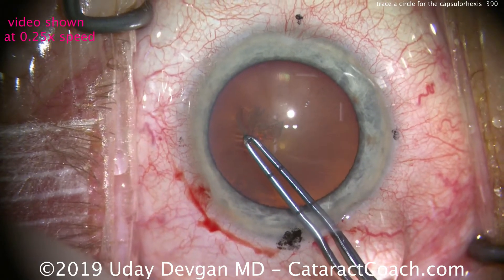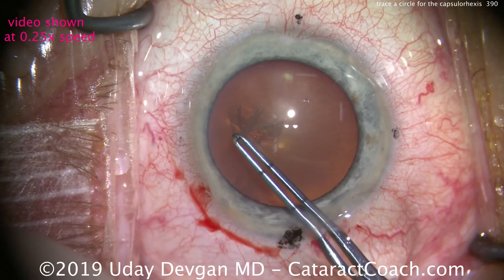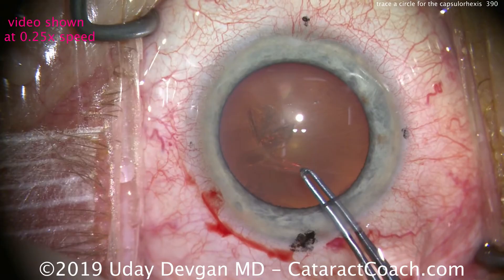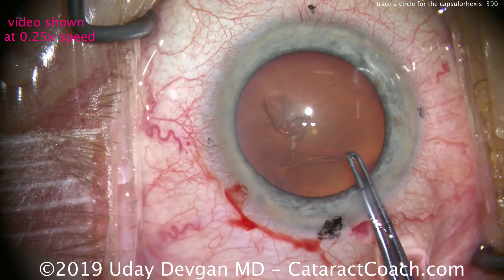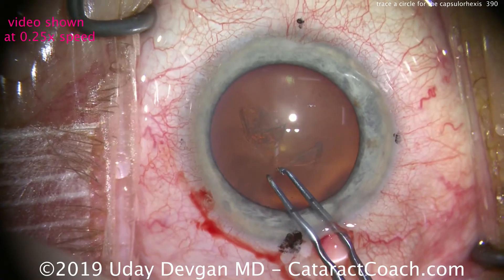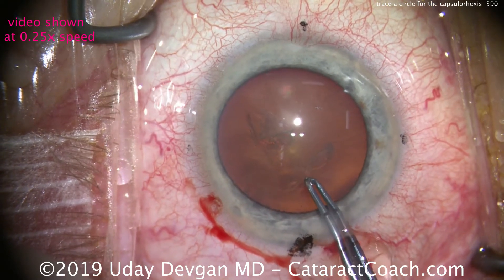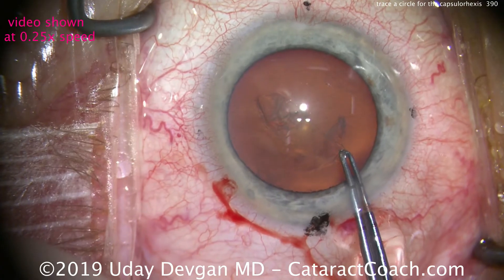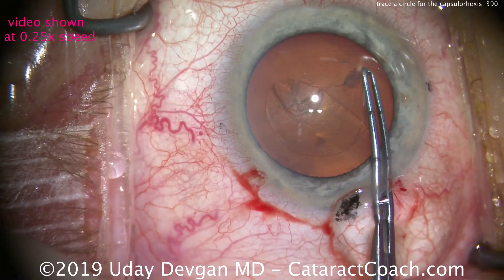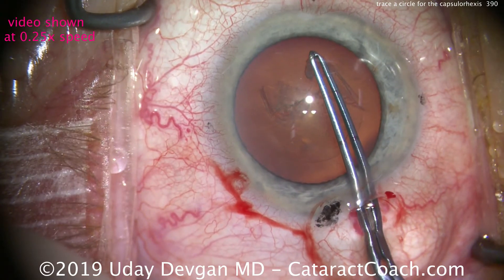As these tips move in a circle, grab and move in a circle. The tips trace the five millimeter circle, and the flap follows naturally — we end up with exactly that size capsular rhexis. Grab the forceps, tips holding the flap of anterior lens capsule, and the tip of the forceps traces a perfect circle.